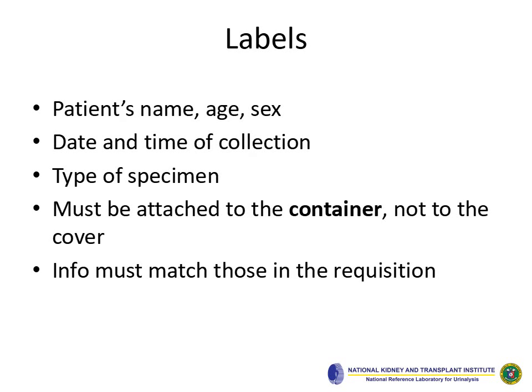Labels must have the patient's full name, age, and sex, date and time of collection, and type of specimen. The label must be attached to the container and not to the cover, as this could get lost. The information on the label must match those in the requisition.